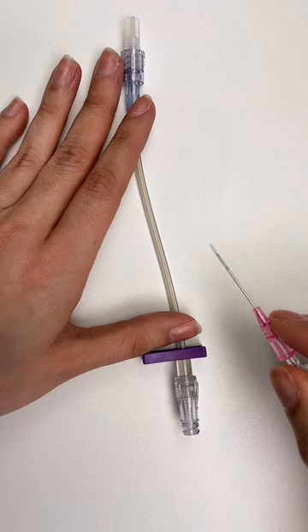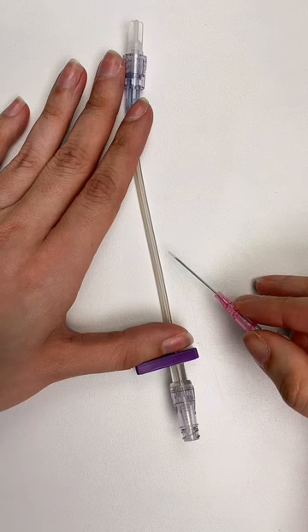Remember, a lot of this catheter and this needle is going to be in your patient's skin and their subcutaneous tissue before it ever reaches that vein.